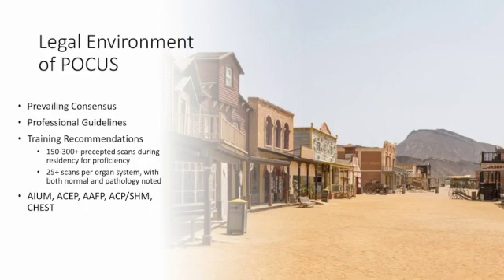This is not specialty specific, so the American College of Emergency Physicians and hospital medicine, those organizations have adopted some of these numbers, but there is no formal, overarching multi-specialty organization that recommends anything other than the AIUM, which is what I go off of. And the other thing to remember is that as this technology grows, expect the legal environment to change, and expect to need to stay in touch with that if you want to continue to use this technology in your practice, which I wholeheartedly recommend.